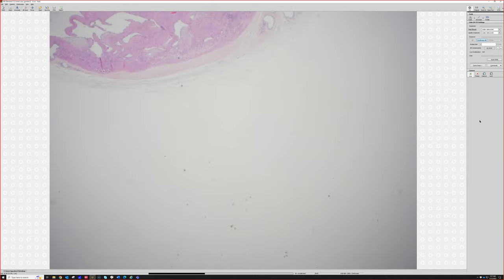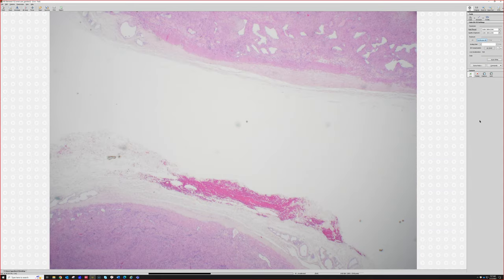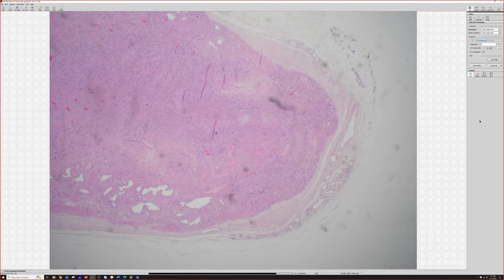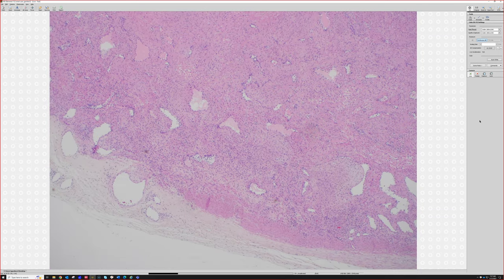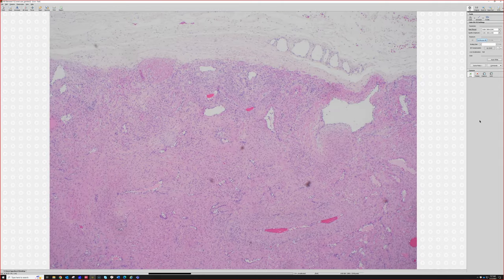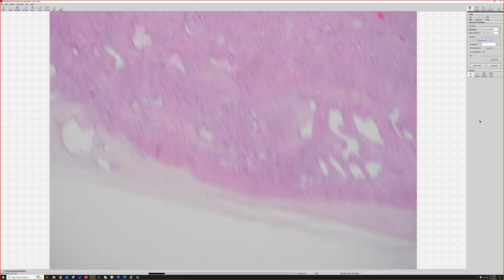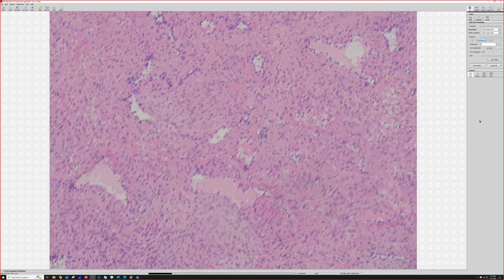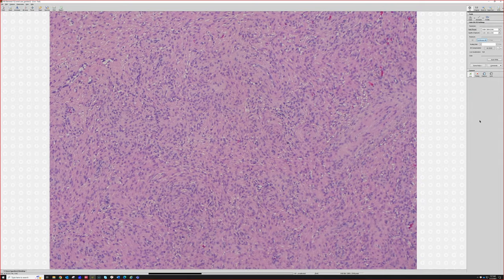All right. Does anyone know what this thing is? Or ideas, differentials? About angioleiomyoma? That is an excellent thought. And it does look quite pink. And then in other areas, though, it looks a little different. So, like right here, it really looks like smooth muscle and vessels inside, right? So, angioleiomyoma. But then over here, we get a little bit different pattern.